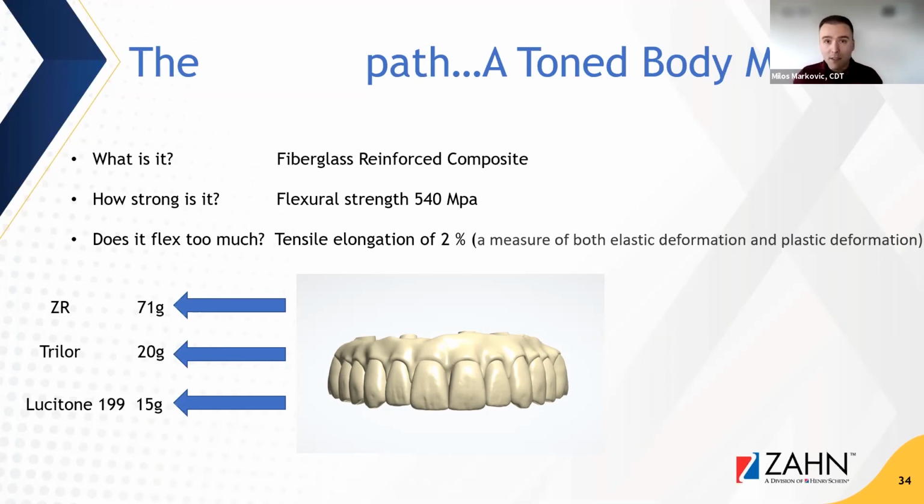So as we take these paths, it's important for you to consider, if the doctor says, hey, I don't want to have a heavy restoration, what options can you give me? Well, doc, I can give you maybe Trilor layered with Gradia, or I can give you a Lucitone. Okay. But if there's no concern, and it's like, but I want something really strong and aesthetic, you're like, well, I got transitions for you. So it's important to consider those weights of things. So what is a Trilor?